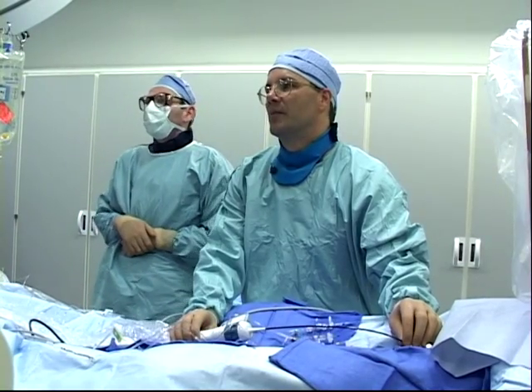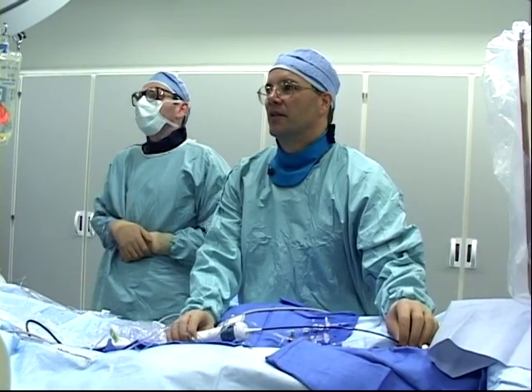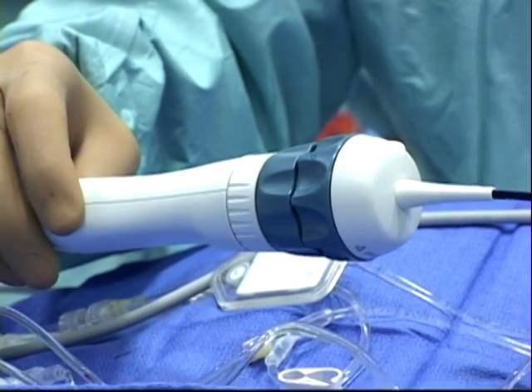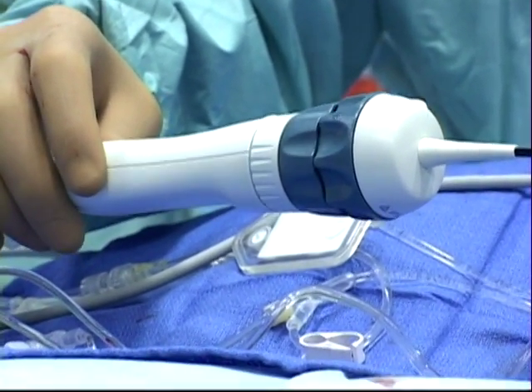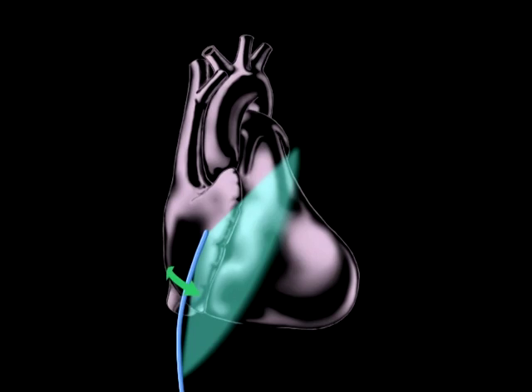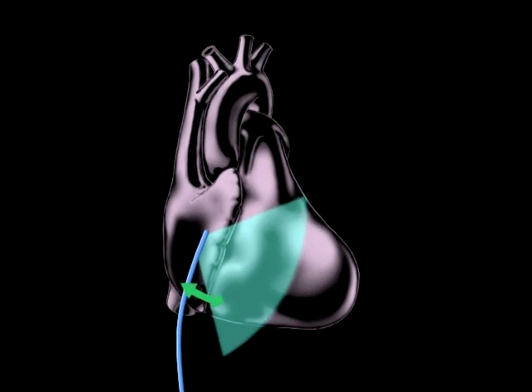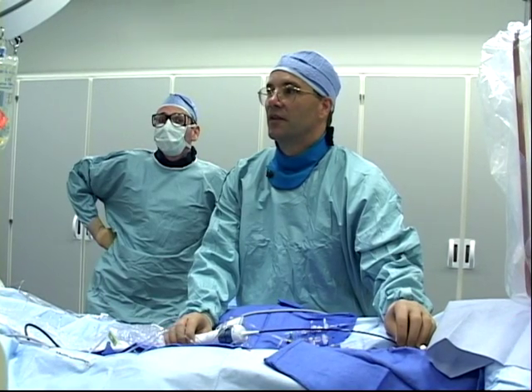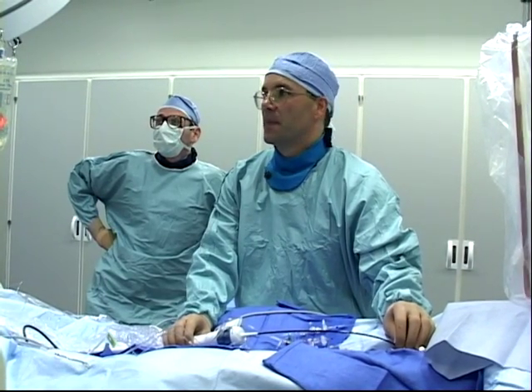One thing that's very important in manipulating the catheter is very subtle movements in the clockwise and counterclockwise direction, with the idea that you're directing a very large imaging plane from the tip of the catheter. So very subtle movements move it through space in a big direction.